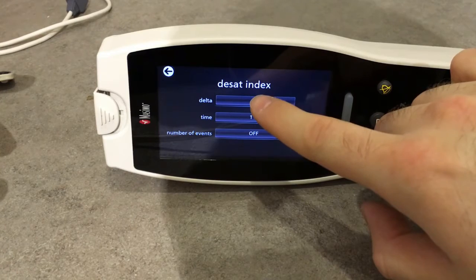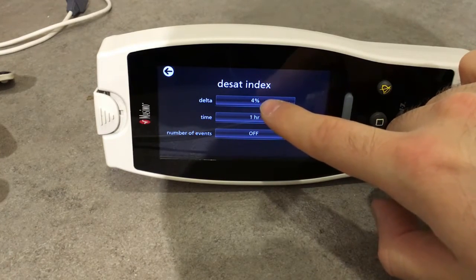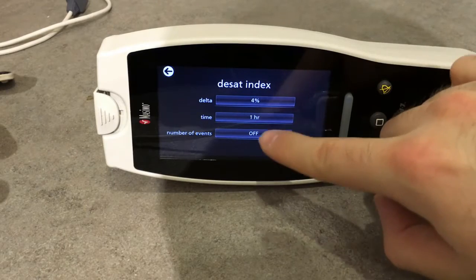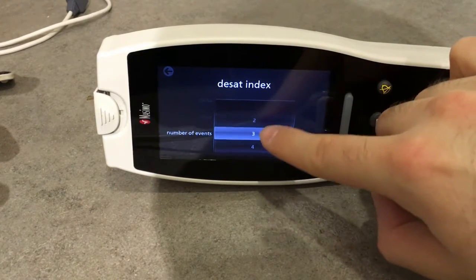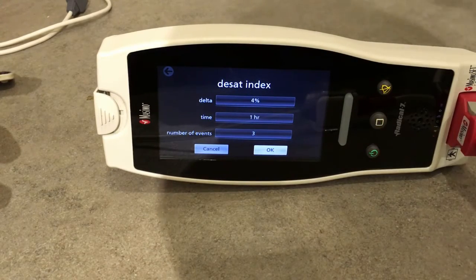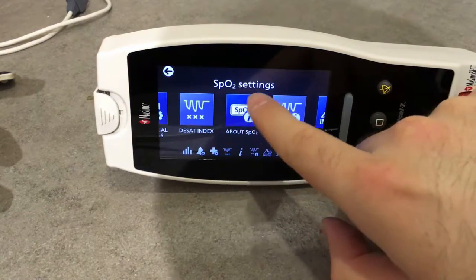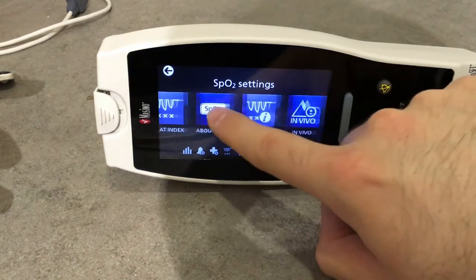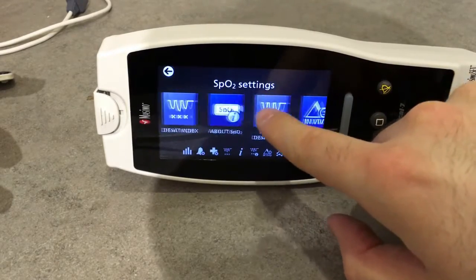Here we can also set the desat index. If there is a desaturation of 4% or above in SpO2 occurring multiple times within a one-hour window, this pulse oximeter will give an alarm. We also have a brief description of those functions and what SpO2 is.